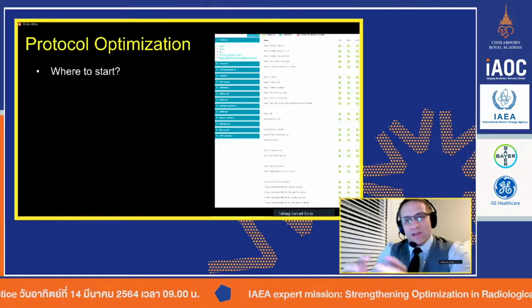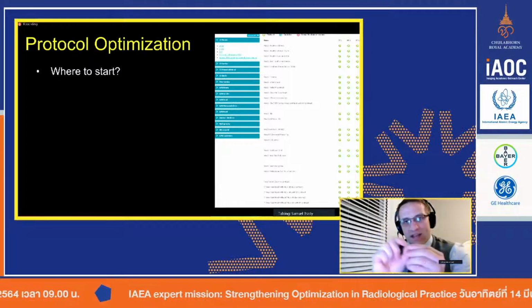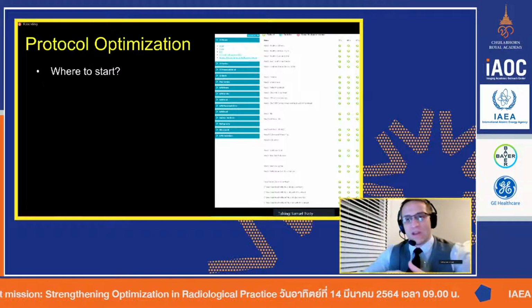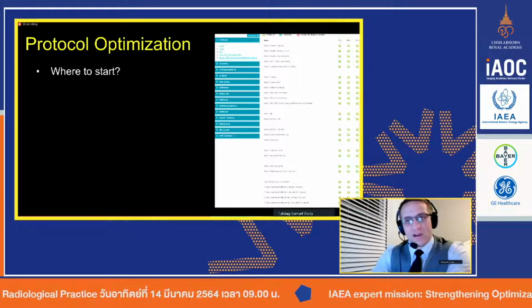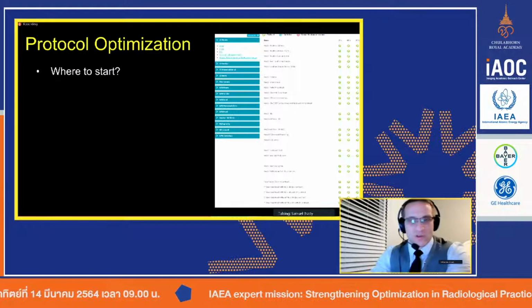Image quality is great at the image level, but when we take it up a couple of levels, we need to think of it more globally. We have a protocol. And we have our ordering physician. Let's say a kid appears in the ER, they got in a car wreck, they hit their head, so there's potential for trauma.